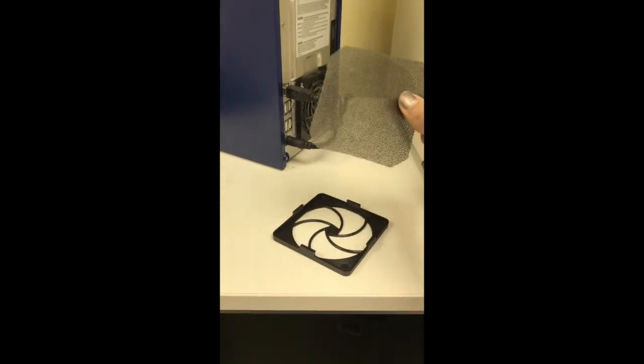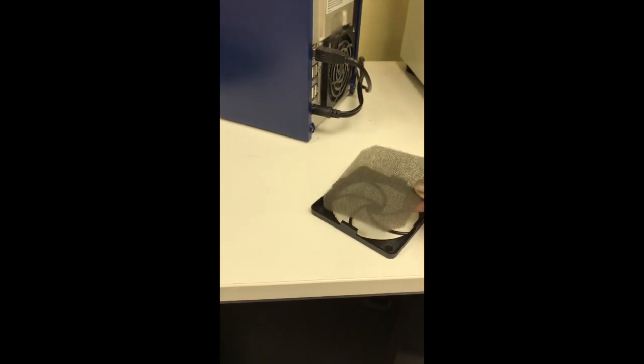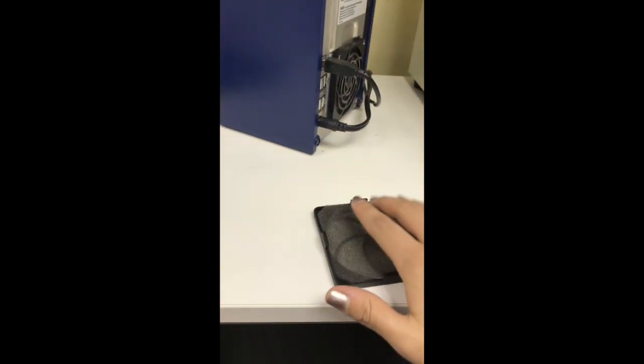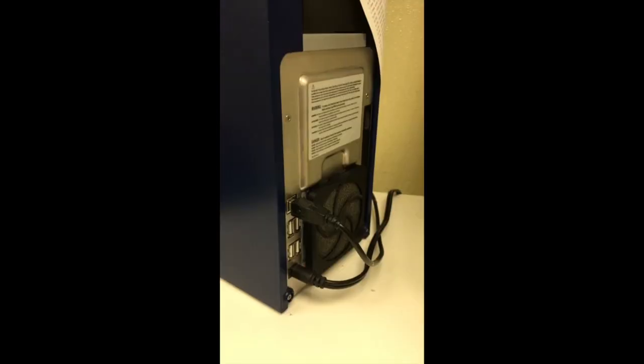So here I have a new filter for our diagnostic machine that I'm going to put in. I just place it right back in the container, just like that, evenly, and then I put it back on our machine. And there's our new filter.